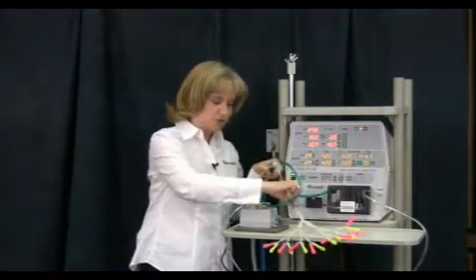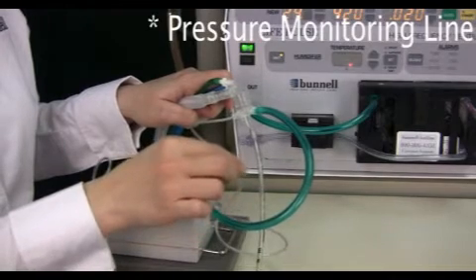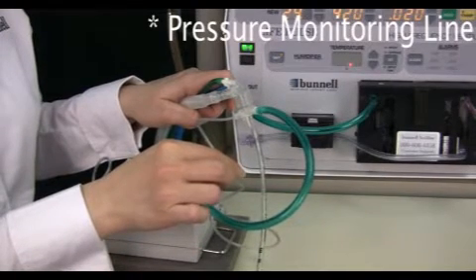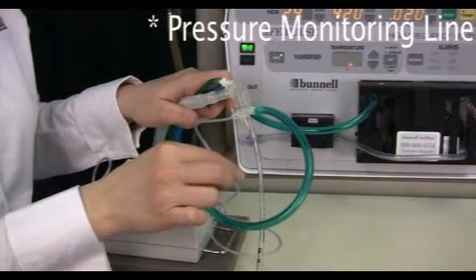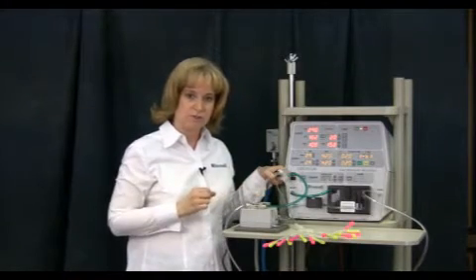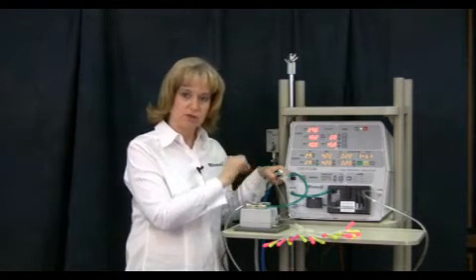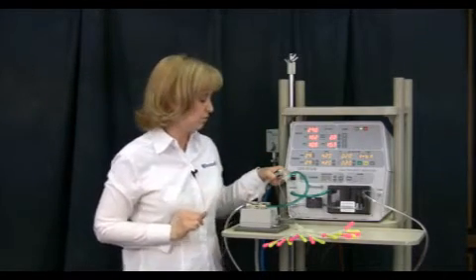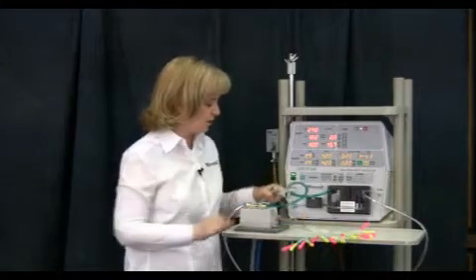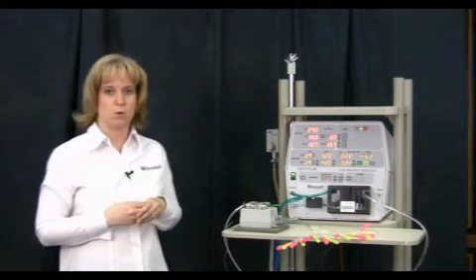Also, the pressure line here. If this pressure line becomes full of secretions or any kind of condensation, then this could also cause some fluctuations in my peak inspiratory pressure. So if you see any little bead of water or something bouncing around in this pressure line, then you're going to see fluctuations in that servo pressure. So you can either change out your adapter or you can manually purge your pressure line.